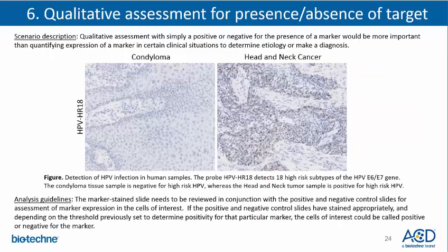In this final category for singleplex staining scenarios, a qualitative assessment of the target expression is needed, and a simple yes or no answer for marker presence is more important than actually quantifying the expression of that marker.